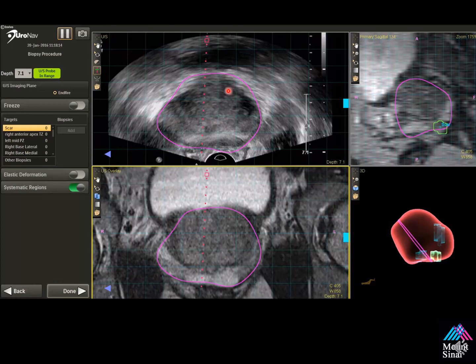Notice the hypoechoic area shows up here, matching up with the MR ultrasound fusion image. It's always important to look at the raw ultrasound image during the procedure — sometimes the regions of interest colored on the screen make it difficult to see. Notice the needle comes in here — I'm going directly through my ROI. The needle tip stops up here, and you're able to adjust the needle and record where the biopsy was taken.